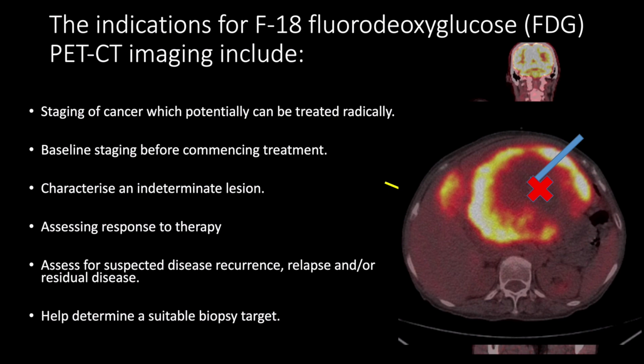The pathology result might be equivocal. If, however, you chose to target your biopsy more peripherally, where we know it is hot on the PET scan, you're likely going to harvest a positive sample of cells. So this is clearly the best place if you're going to target doing a biopsy.